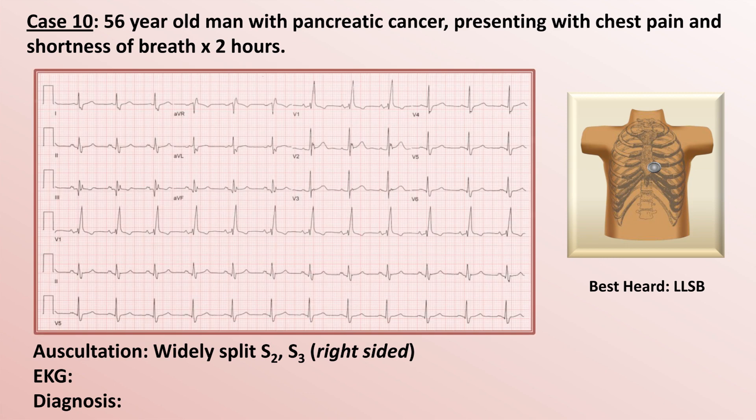Now the EKG. The rate is normal, around 75 beats per minute. There is a one-to-one correlation between P waves and QRS complexes, and the P wave axis is normal — upright in lead 2 and downgoing in AVR. Regarding duration, although the QRS duration may appear normal in some leads such as V3, it should always be measured in the lead where it appears longest. In this case, that is either V1 or V6.